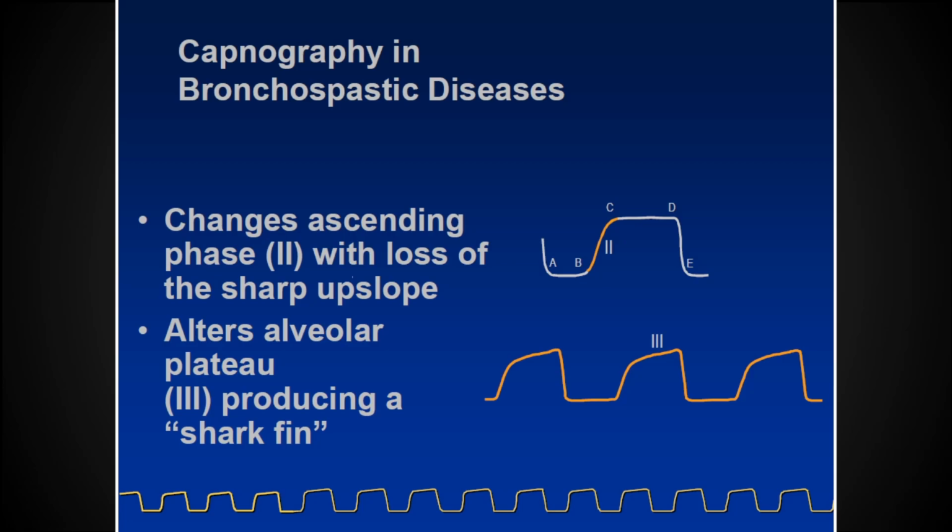So where this takes place is you see a guy that's having trouble breathing and somehow missed the fact that he was a congestive heart failure patient, I guess. I mean, it does somewhat happen. I guess I shouldn't be so pointed, but what this means is you auscultate lungs and hear wheezing. You put them on end tidal and see this, it means bronchodilators. You listen to lungs and you hear wheezing and rhonchi and rales and all kinds of soup like you usually hear, and you put them on end tidal and don't see that, then it does not mean bronchodilators are going to help him.